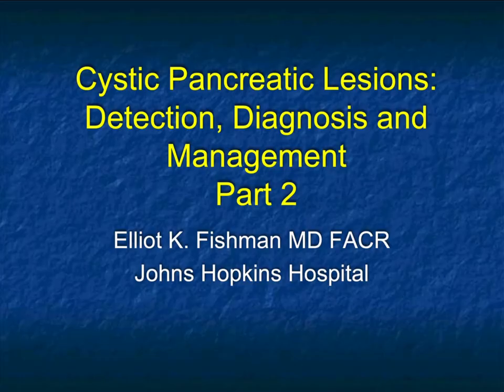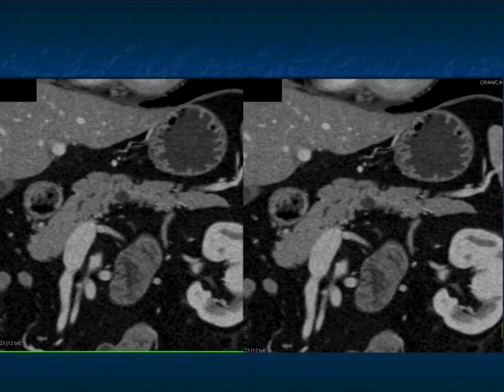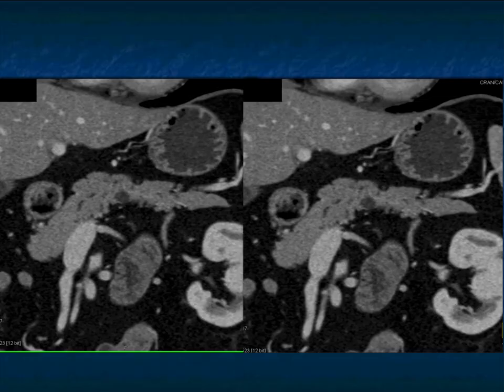Hi, this is Elliot Fisherman. Welcome to part two of our talk on cystic pancreatic lesions. When we stopped at the end of part one, we were discussing the importance of looking for small lesions with IPMNs. We talked about main duct IPMNs, side branch IPMNs, and mixed type IPMNs.